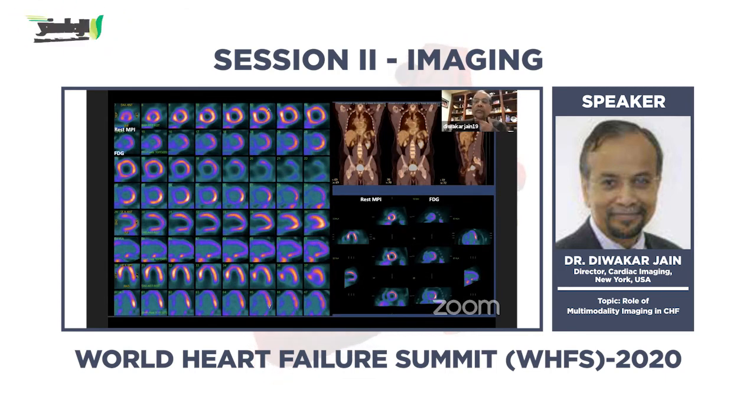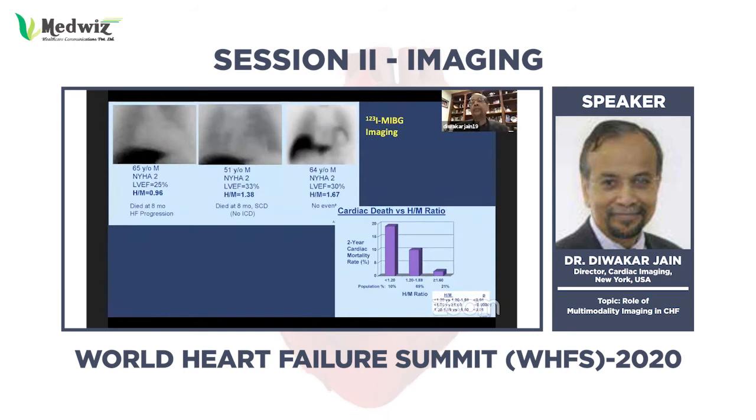Again, nuclear imaging modalities can be considered as a very important technique, much better than echocardiography, or as good as magnetic resonance imaging. You can see delayed enhancement in patients where there is significant fibrosis, but inflammation is something unique for nuclear imaging.